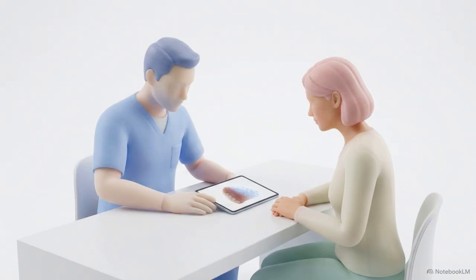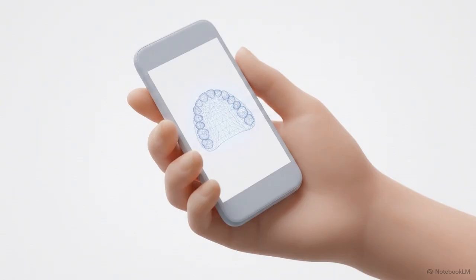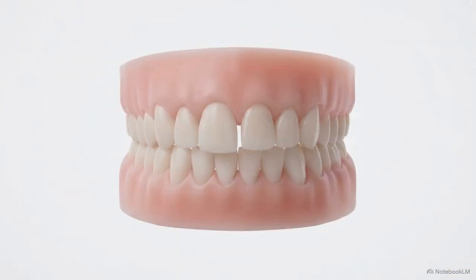Step 3 is the review appointment. This is where you see the simulation, and there is one critical rule you must follow. Demand to view the mock-up on a large screen. Reviewing the design on a small smartphone display makes it incredibly easy to miss subtle proportion errors that will become glaringly obvious once the teeth are actually in your mouth.